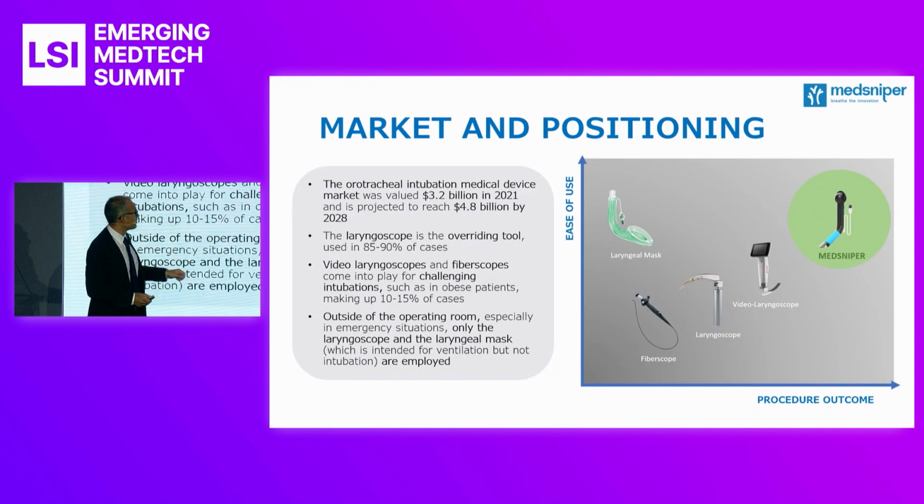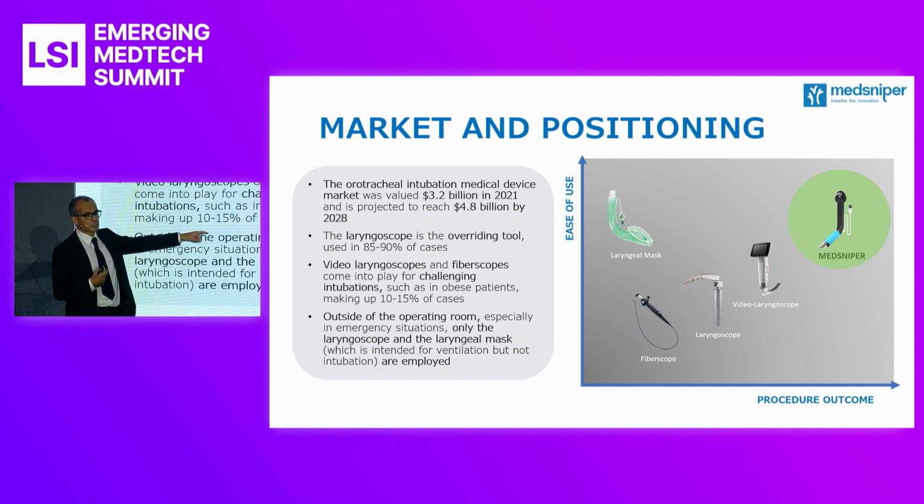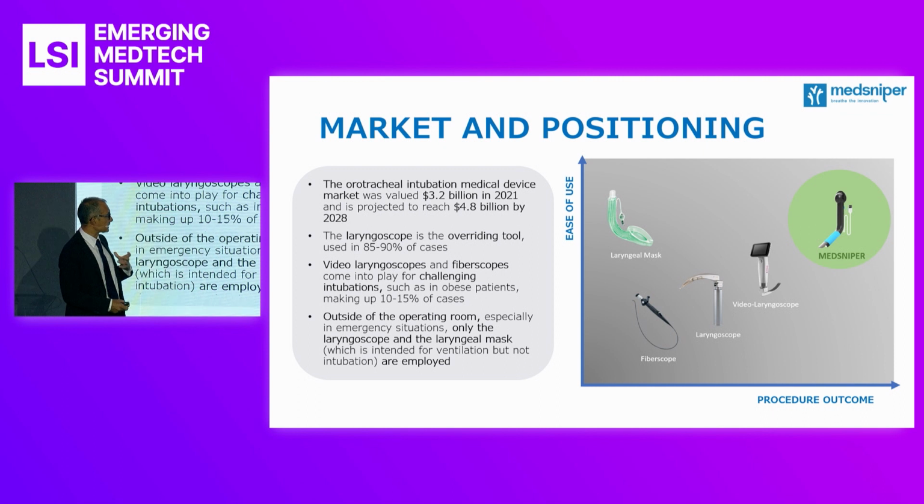So another important thing is that usually we use a laryngoscope. We used the laryngoscope 10 years ago. That was the standard. But a laryngoscope is all steel going on the tissues, going on the teeth. Now we have video laryngoscopes with a video camera, but we still have a success rate which is not complete, and the necessity to make the maneuver, and so the possibility to be traumatic.